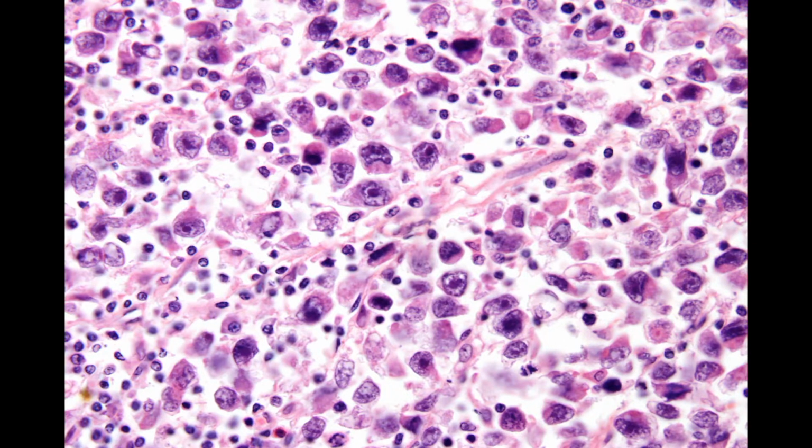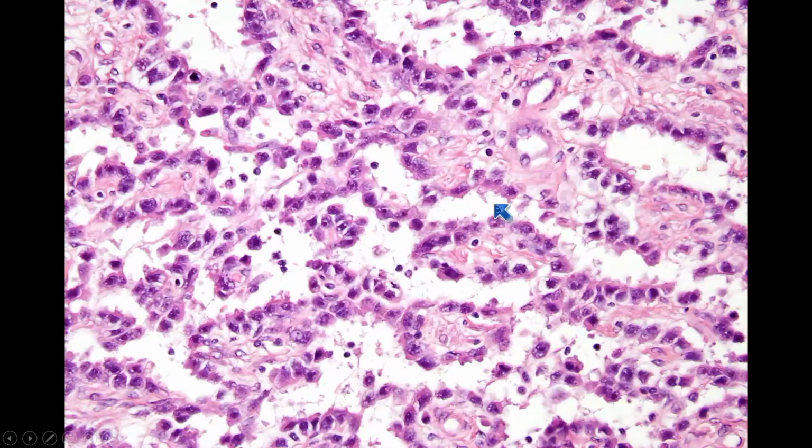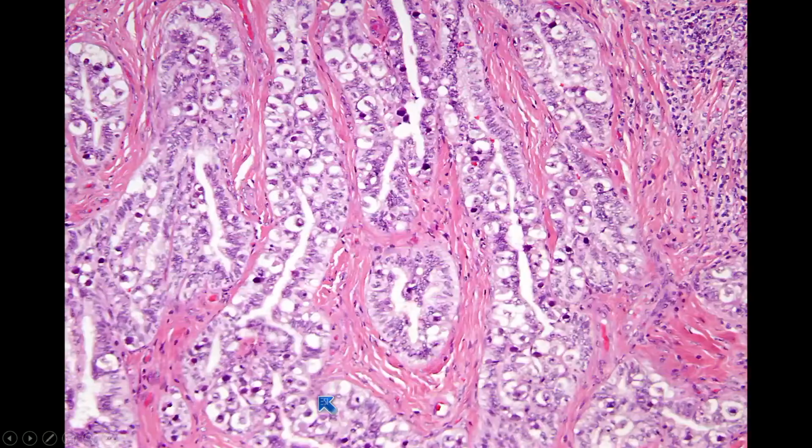We recognize we still have the sprinkling of lymphs, and that nice central nucleolus, just more atypical cytologically. Another pattern of seminoma that's unusual are cords of cells, but that's acceptable. And maybe even more unusual, we can get this pseudoglandular appearance of seminoma, where the cells fall apart, mimicking glands, hence more easily confusable with embryonal carcinoma. Another example of pseudoglandular seminoma.